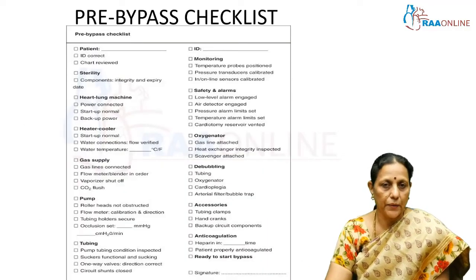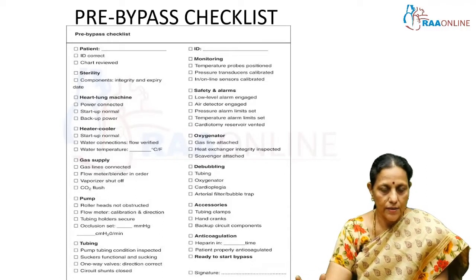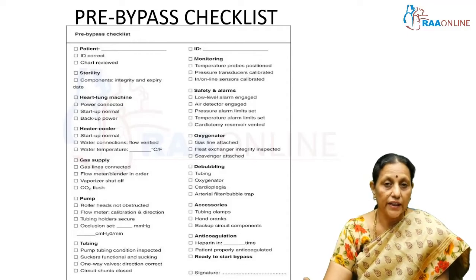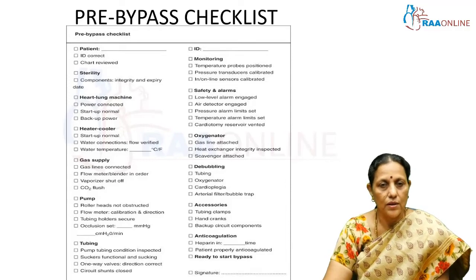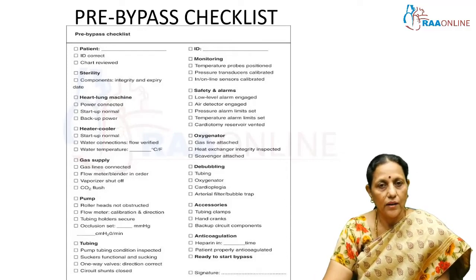Now before any patient is wheeled into the theatre, the perfusionists who are in charge of the heart-lung machine have a detailed plan of checklist. First of all, the patient parameters have to be taken into consideration. The complete diagnosis, the parameters, the height, weight, etc., the lab investigations, all these are charted out in their checklists.